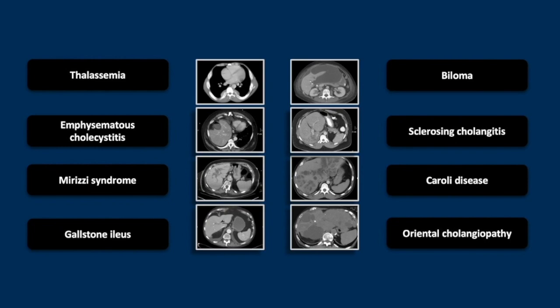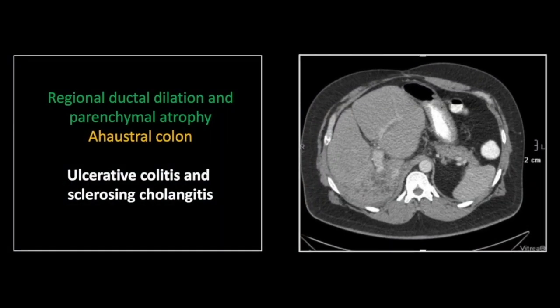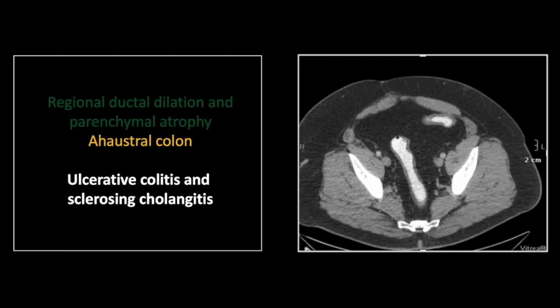Our next case is sclerosing cholangitis. There is significant dilation and approximation of the bile ducts here in the posterior right liver lobe, which demonstrates significant atrophy. In addition, there is a featureless colon with hypodense walls consistent with fatty infiltration and chronic inflammation — all adding up to ulcerative colitis with associated sclerosing cholangitis.